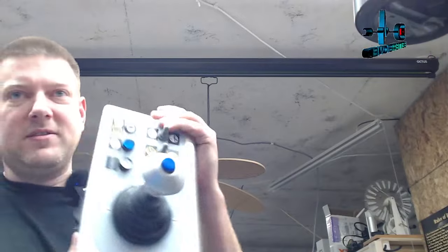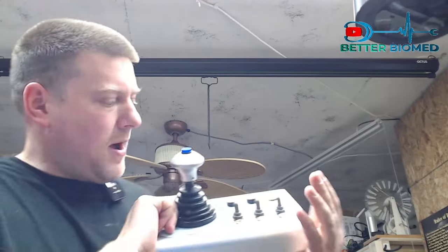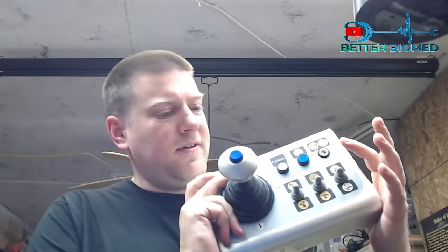Hey everyone, welcome back to BetterBioMed. Today I've got an interesting problem and I'm pretty sure it's going to be the same exact solution for both of these. This is a table control for a DRE table. There's a lot of these type of hand controls out there for all sorts of different types of tables, and I'm going to show you guys a technique today to go ahead and open up some of these cables and check them out, because the answer might not be as simple as you think it is, but it is doable.